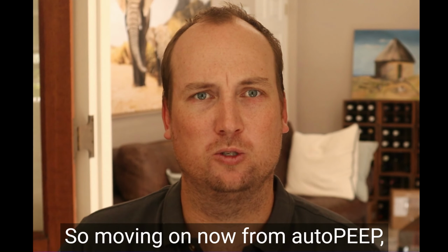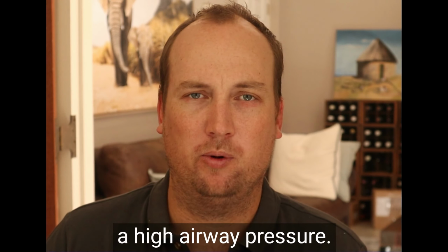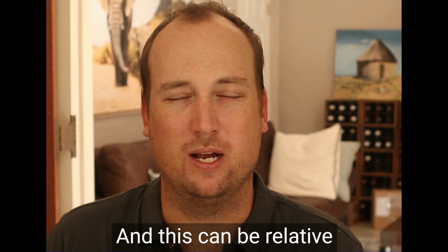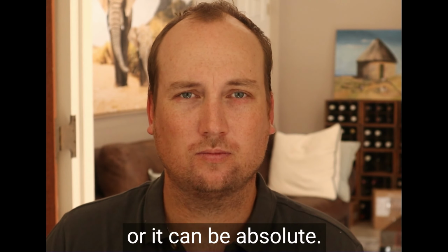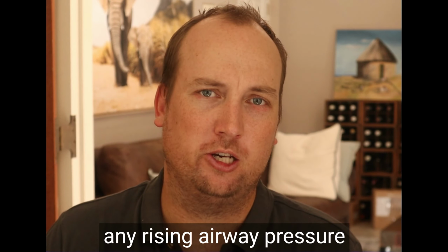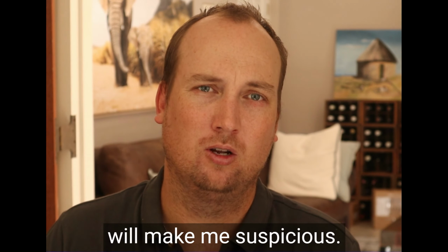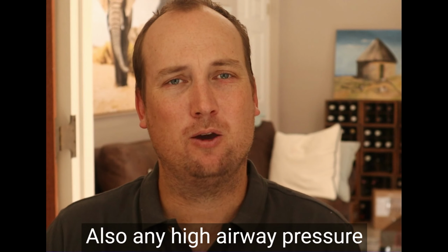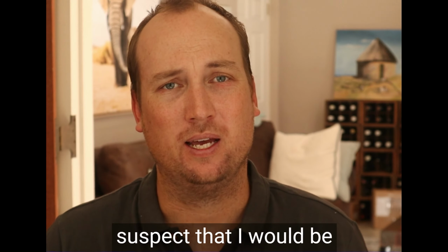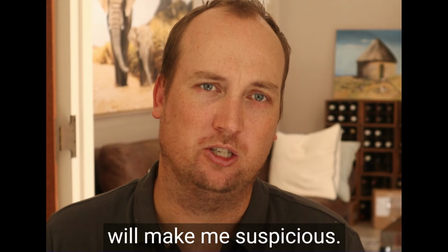So moving on now from auto-PEEP, let's look at our approach to high peak airway pressures. So to start with, one needs an idea of what constitutes a high airway pressure. And this can be relative or it can be absolute. So in terms of relative high airway pressures, any rising airway pressure relative to a previous value will make me suspicious. Also, any high airway pressure in a patient where I didn't suspect that I would be seeing high airway pressures will make me suspicious.